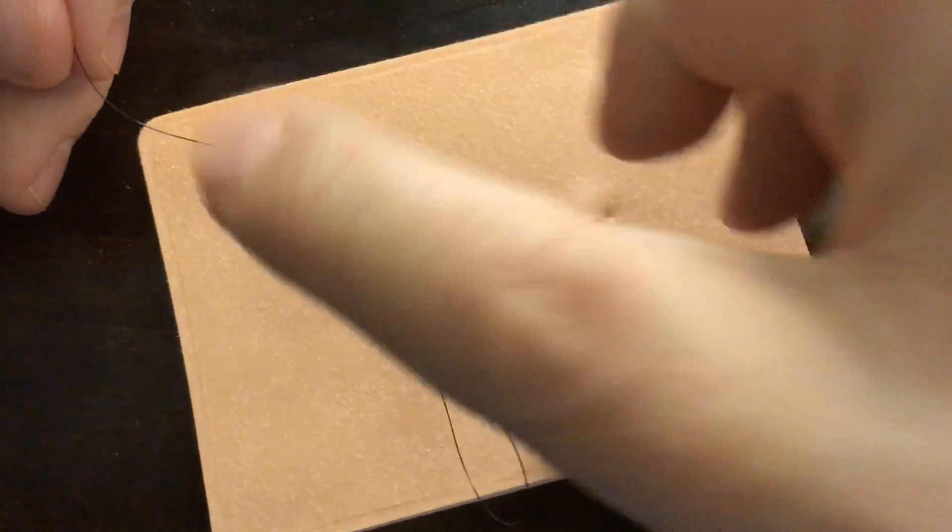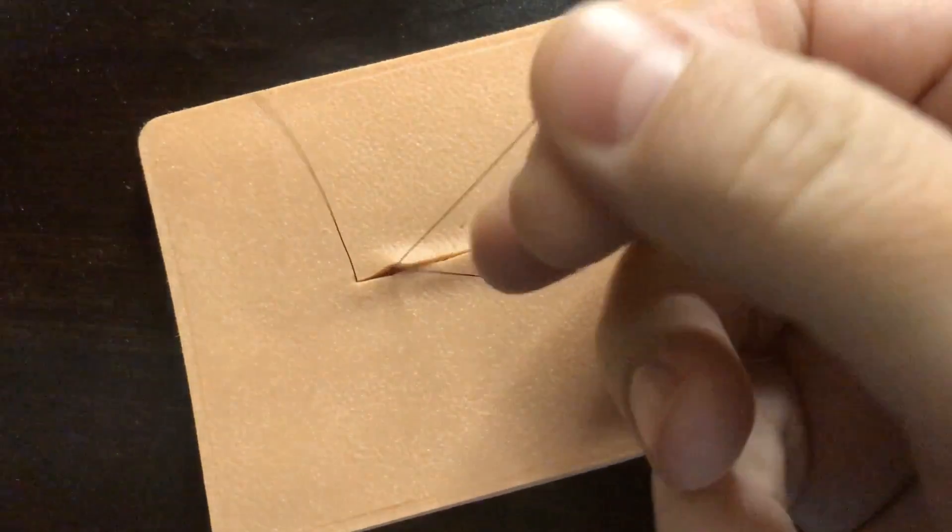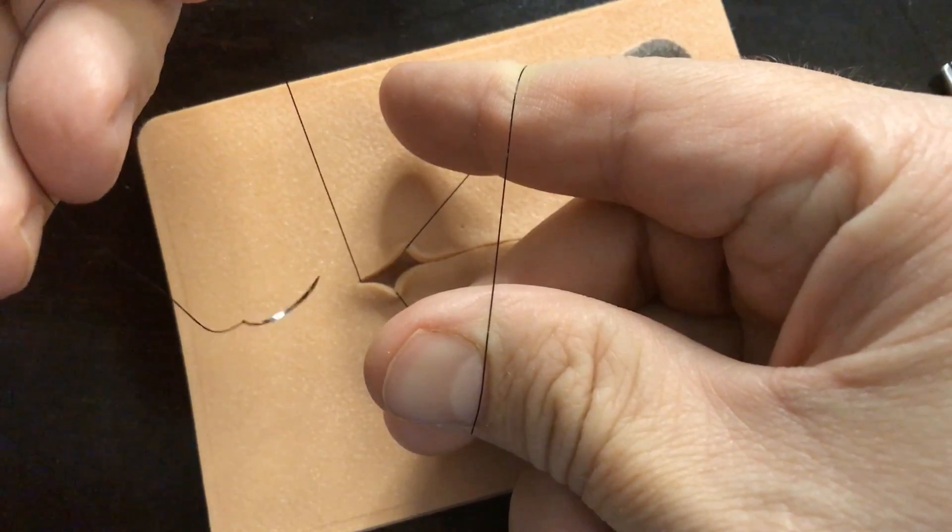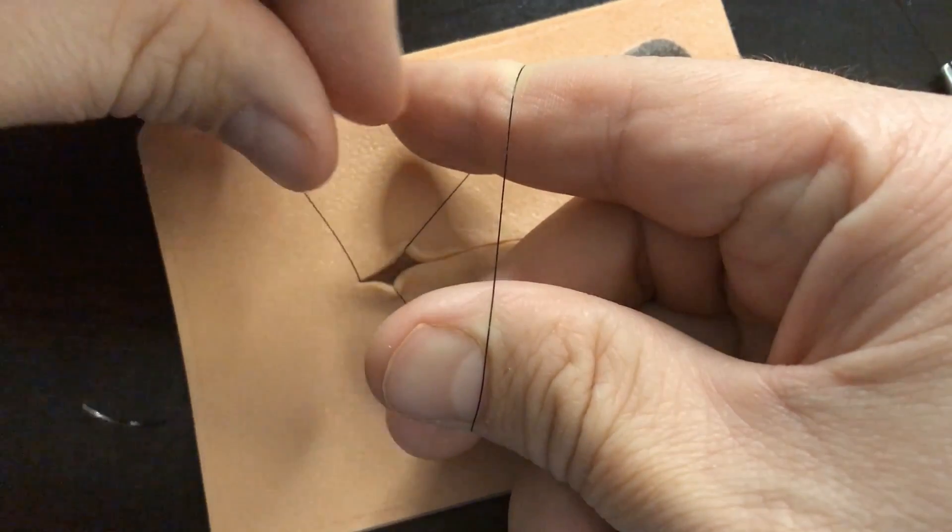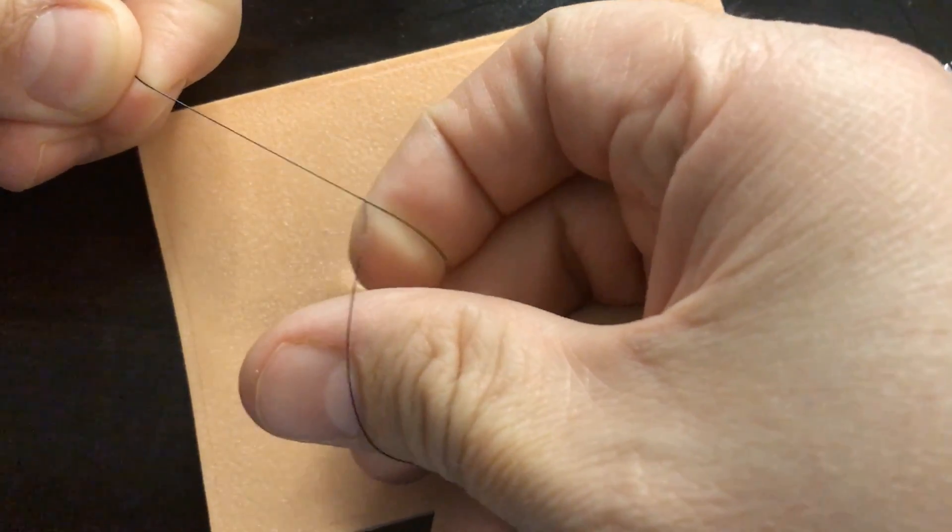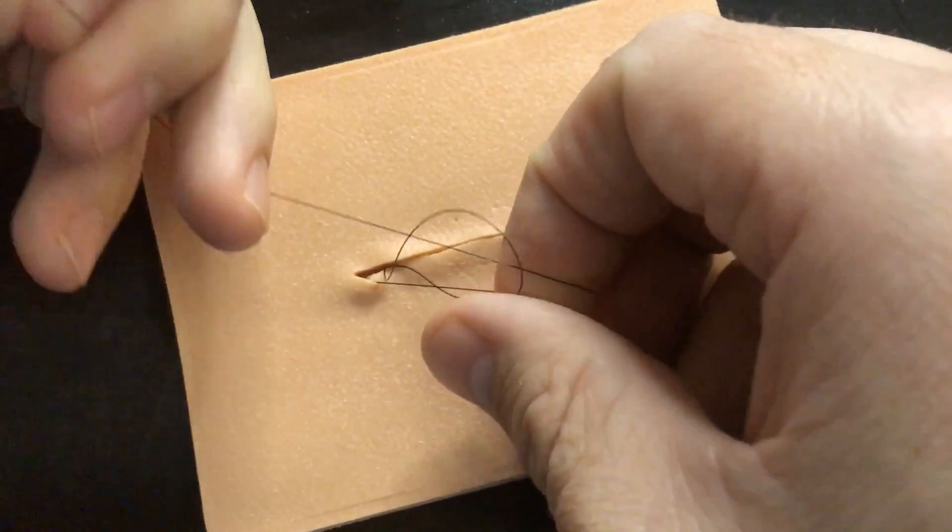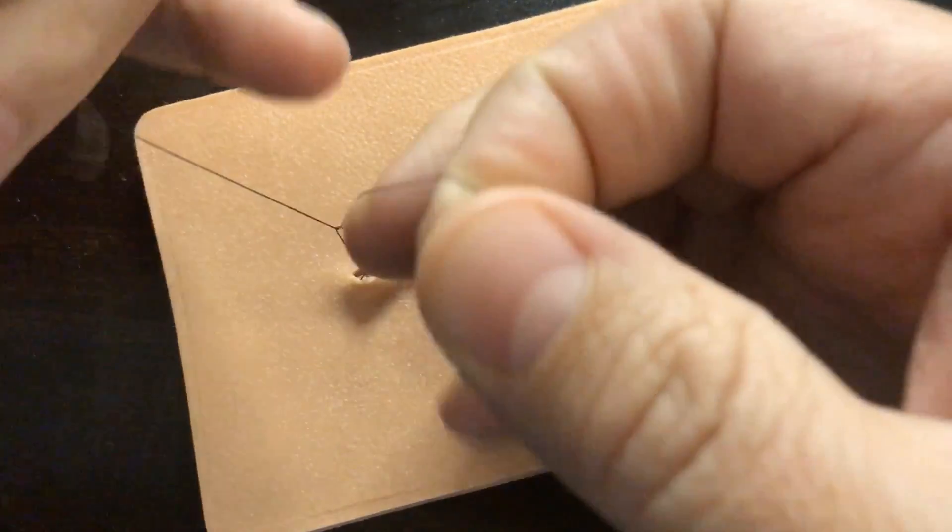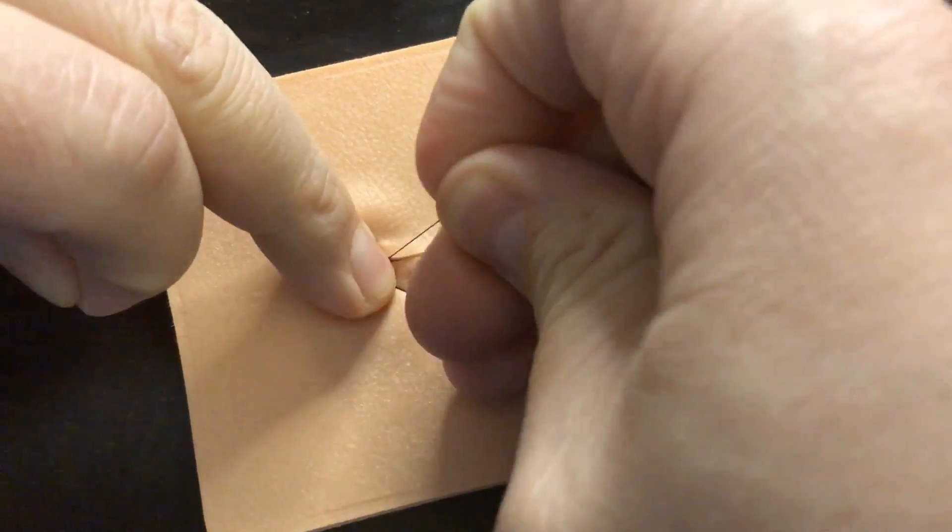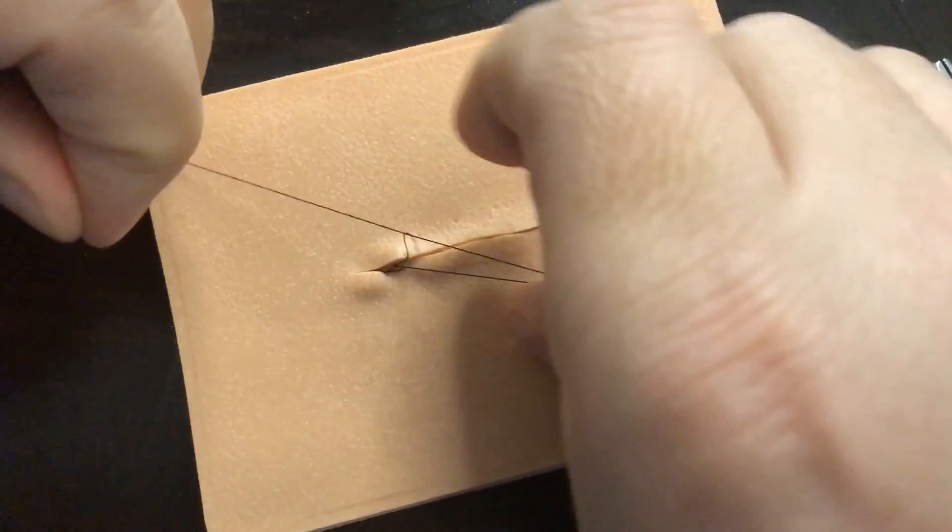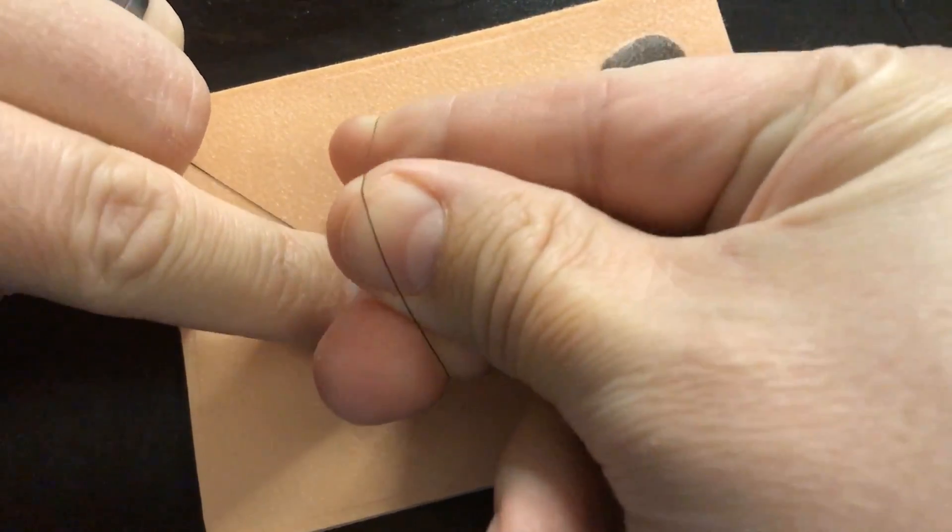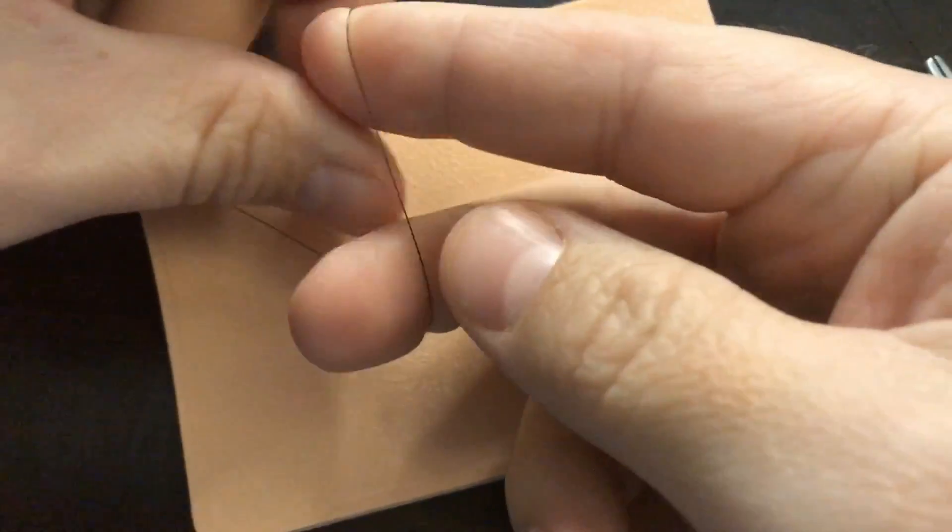And I'm going to use a finger and a thumb. If I can get it. There we go. Finger and a thumb. And then with this side that's got my needle still attached, being careful not to poke myself, I'm going to hold onto this tail. And this is the Aberdeen knot. Loop open, I'm going to grab this and pull it through. That's how I can cinch that down a little bit. First one is not as tight, but second time I'm able to create that knot now using this Aberdeen knot, using this Aberdeen technique.